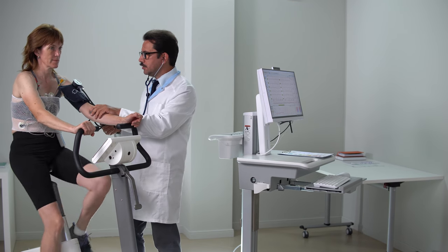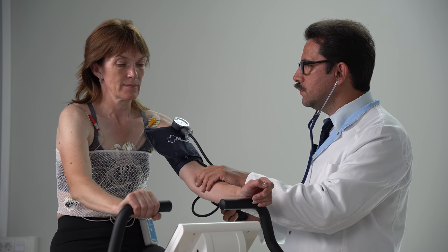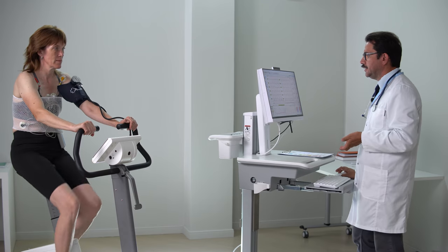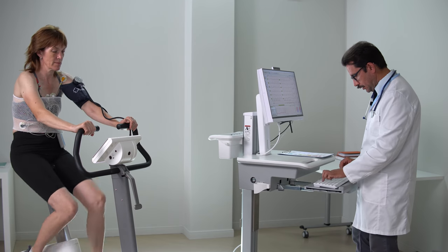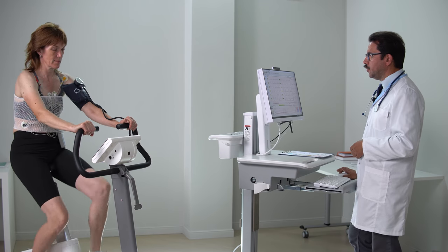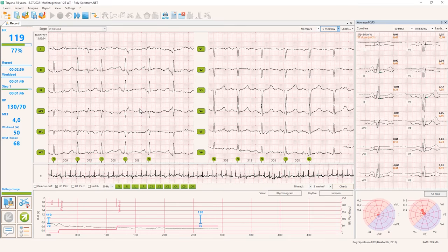It is convenient if you have a technician who can help you. Actually, that depends on your practice. In some countries, technicians do all the tests. In some countries, the test is supervised by the doctor, so it depends. But for sure, it's best if you have a team of minimum two personnel: one person monitoring the patient's ECG continuously and the other person performing blood pressure measurement, some electrode checks and all the stuff around.